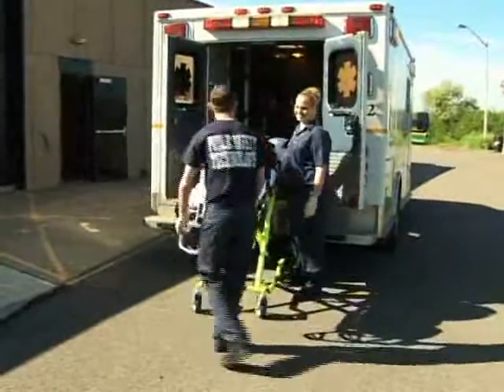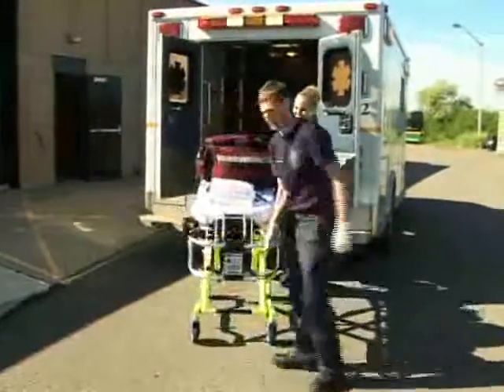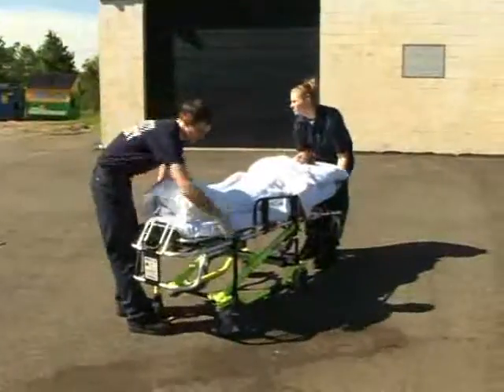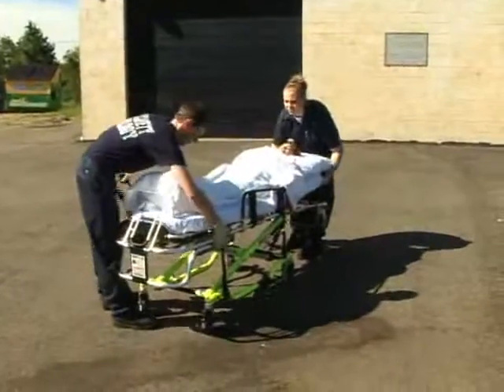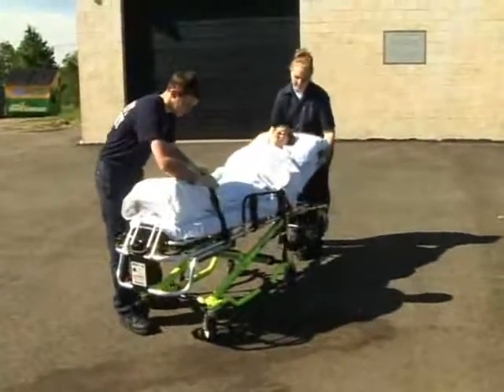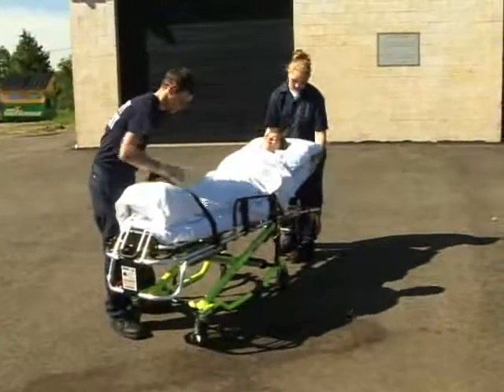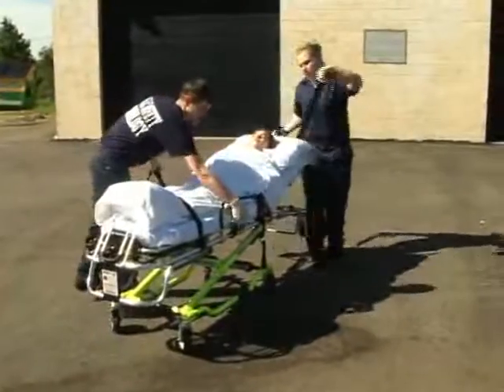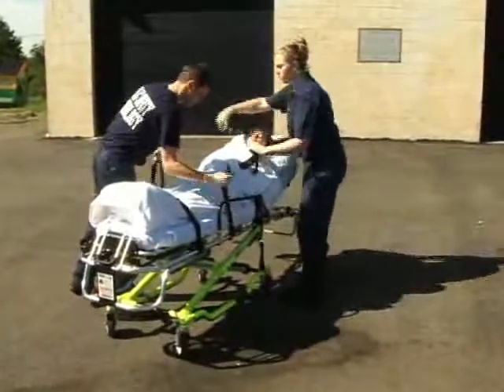Once the wheels are locked, lower the cot to the lowest position. With the patient positioned on the cot, gently raise the head of the cot to a position of comfort, not to exceed 45 degrees.